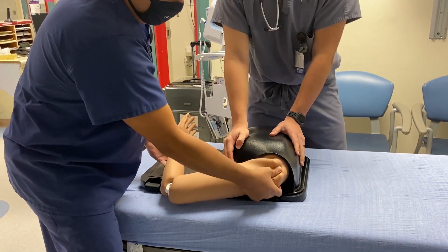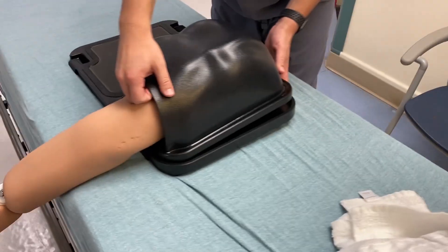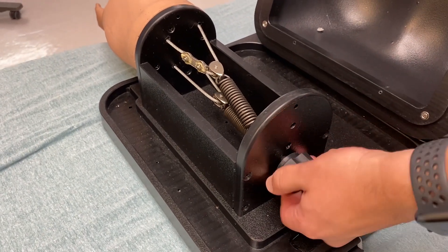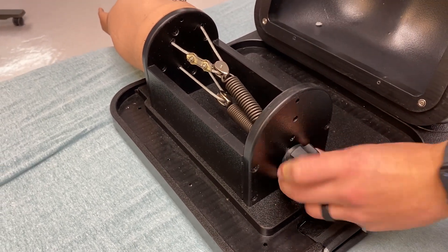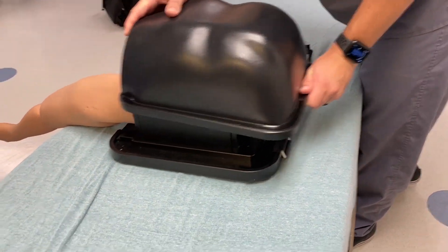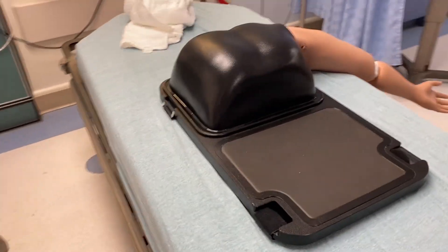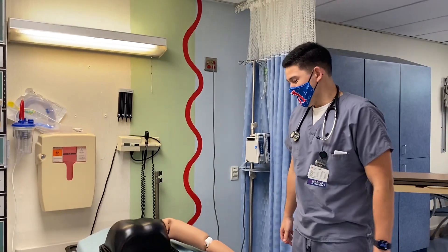Let's look at the mechanism inside the model. The knob here — lefty loosey, righty tighty — you can loosen or tighten the springs to adjust resistance. There's also a soft knee pad that you can use to stabilize the equipment whether you're working on the floor or on the bed.